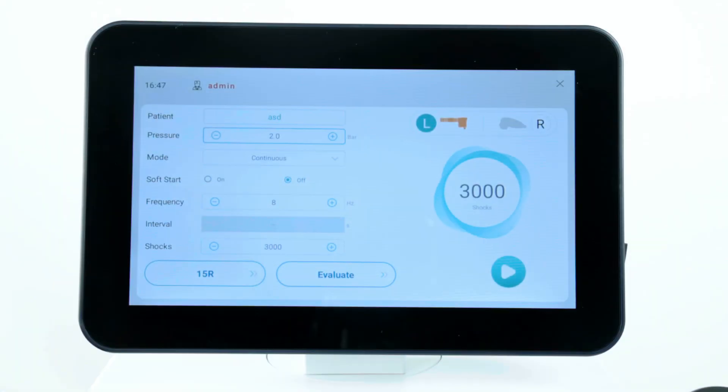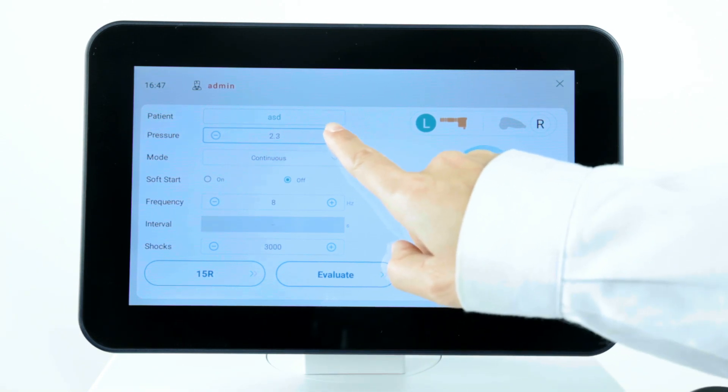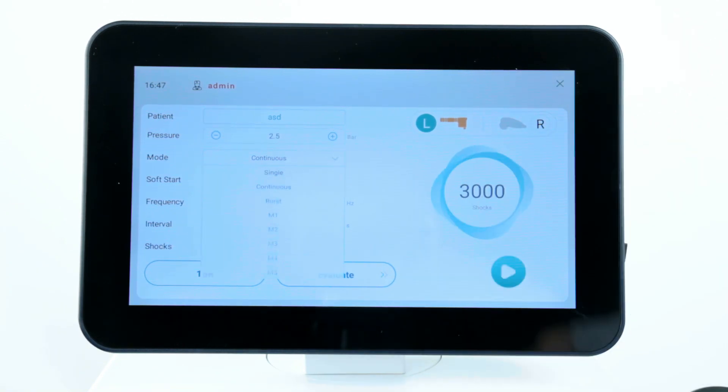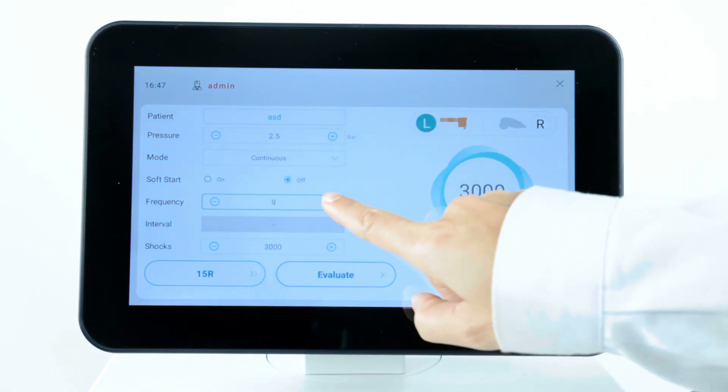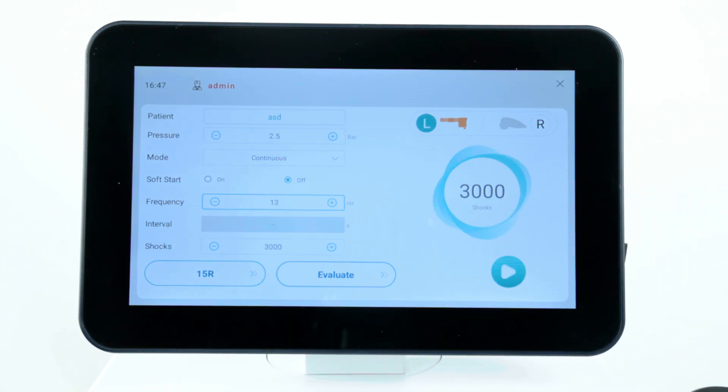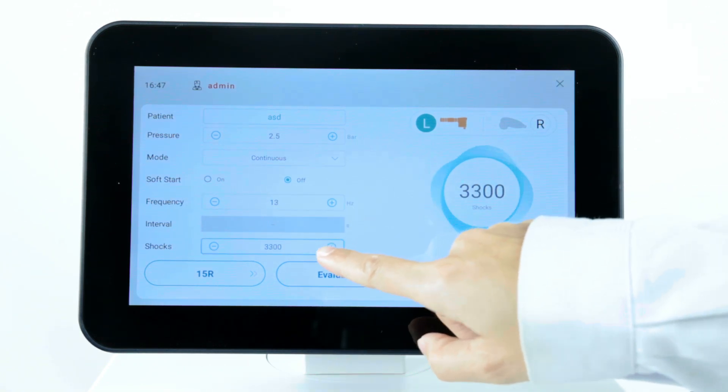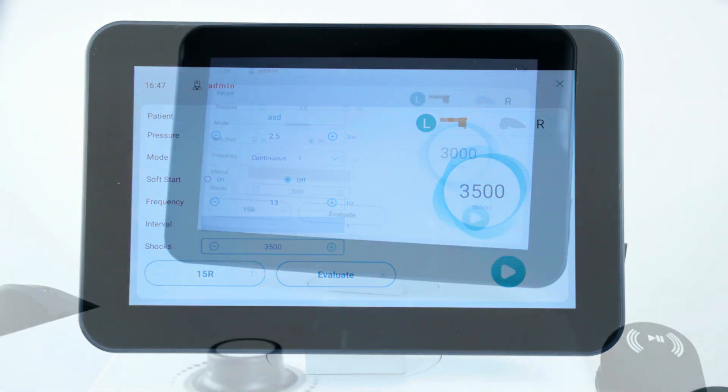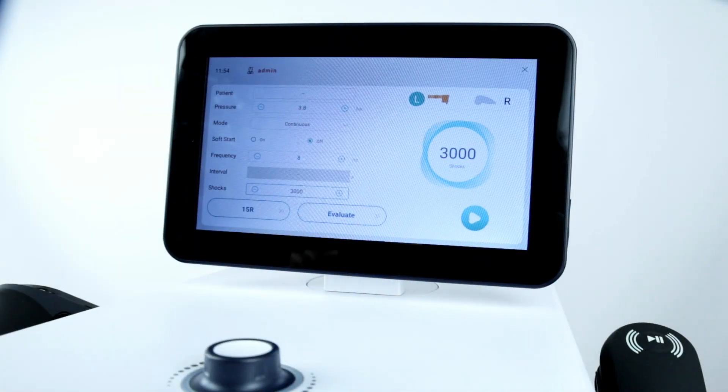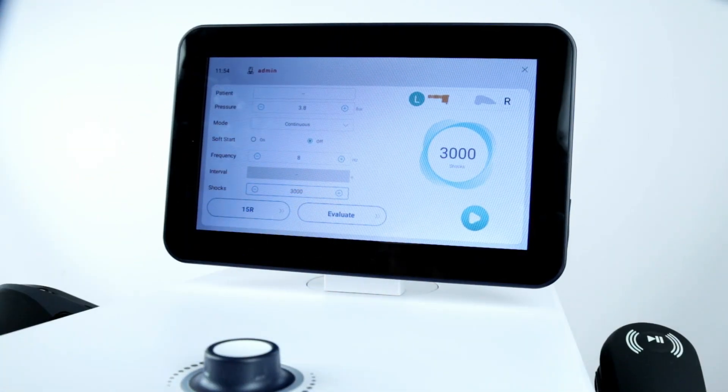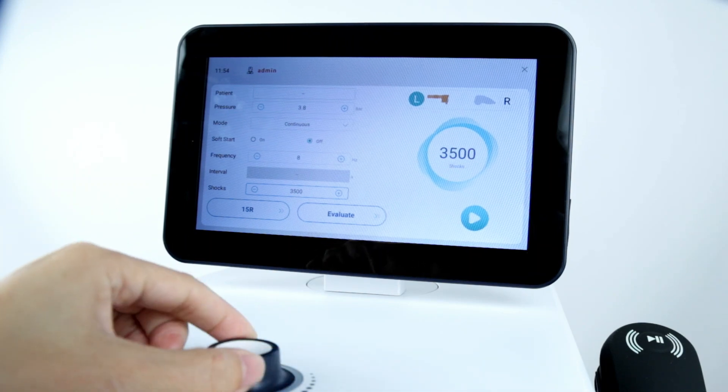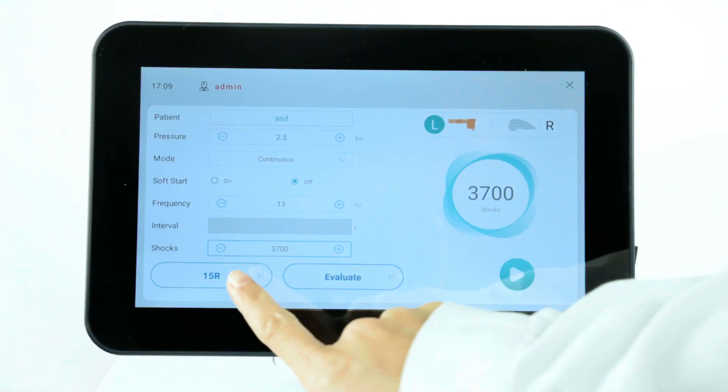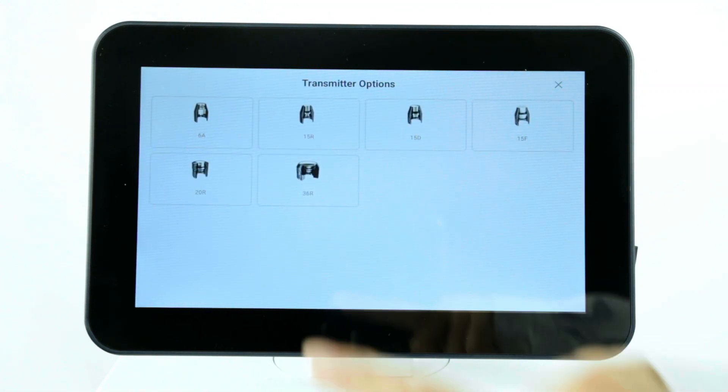Then select the desired settings, such as pressure, mode, frequency, and number of shocks, based on the patient's condition and your professional judgment. You can also quickly adjust the parameter using the rotary knob. Then select the transmitter used for the treatment.